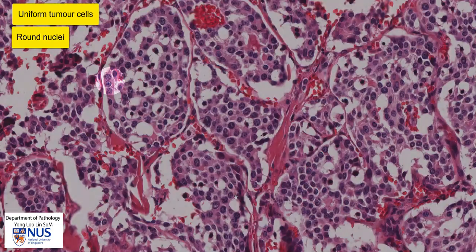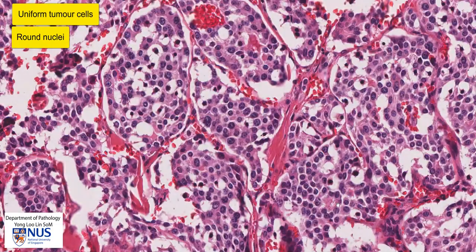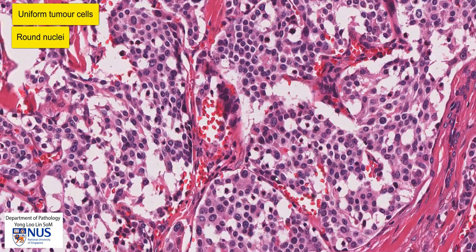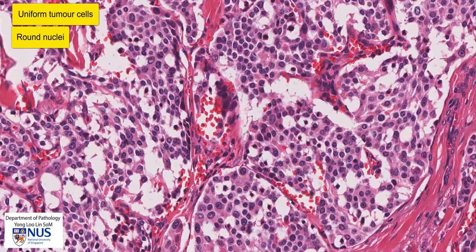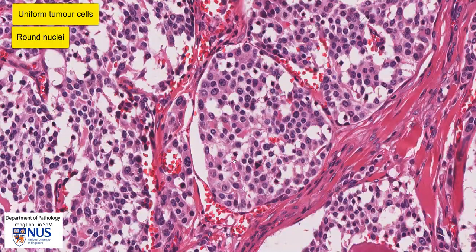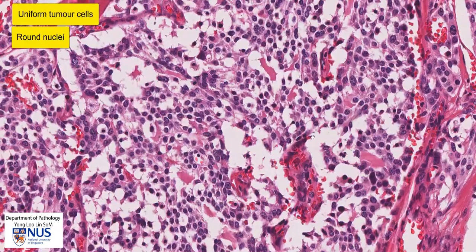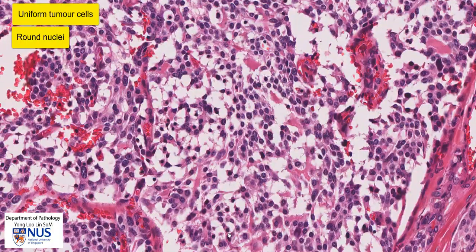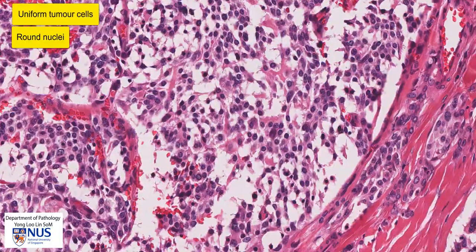There are some larger nuclei. While the majority of the nuclei are of similar size, occasional nuclei are larger than the rest. This is not uncommon in the setting of neuroendocrine tumors. Let's have a closer look at the nuclear chromatin.